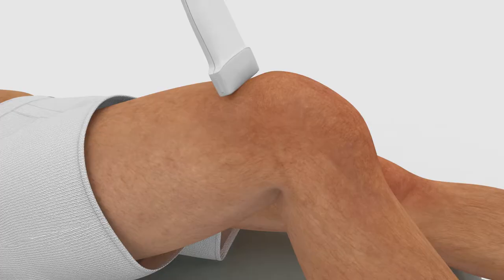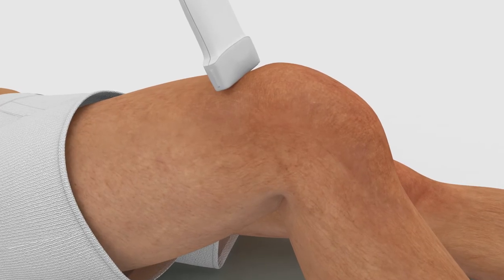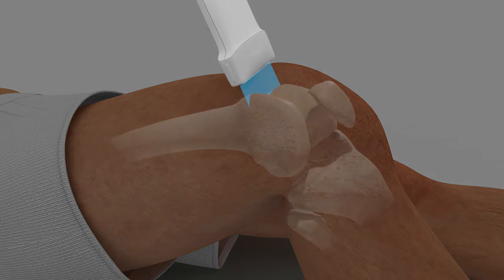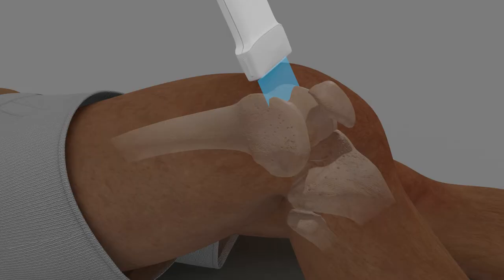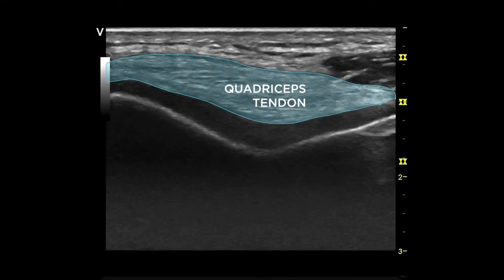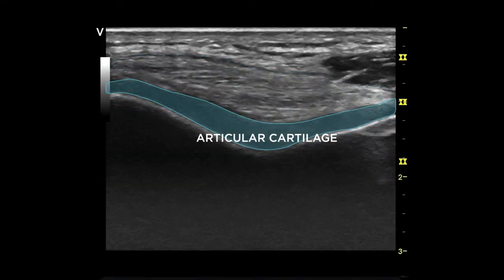Ask the patient to flex the knee. With the probe marker pointed to the patient's right, place the probe over the distal femur. Slide the probe distally to obtain an optimal image of the condyles of the femur. Identify the quadriceps tendon, the femoral condyle, and the articular cartilage.